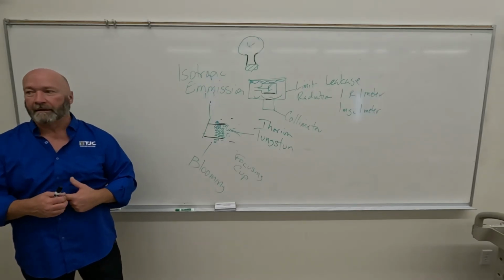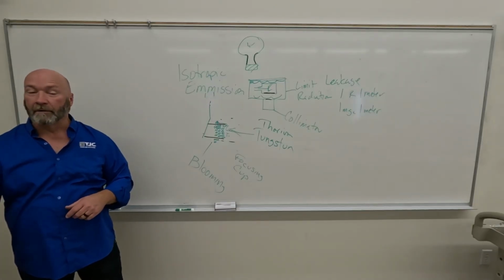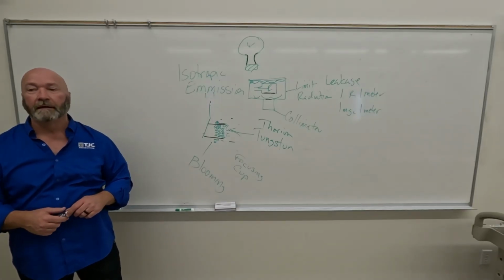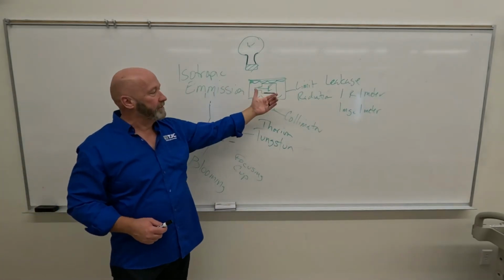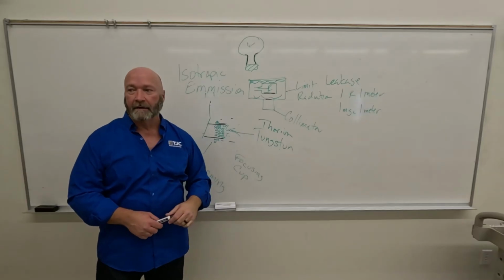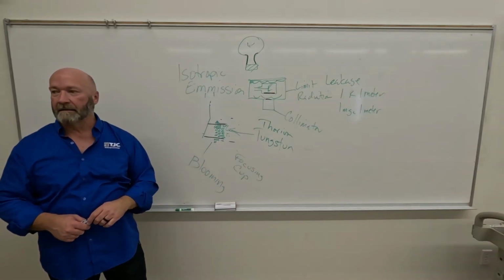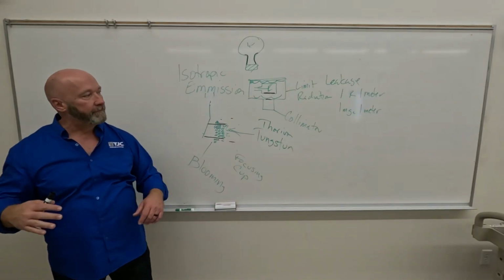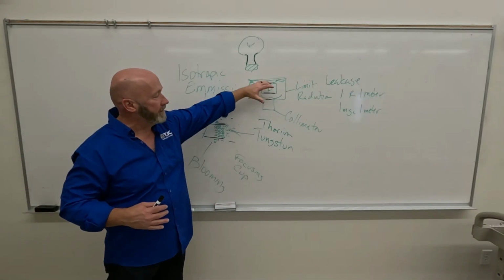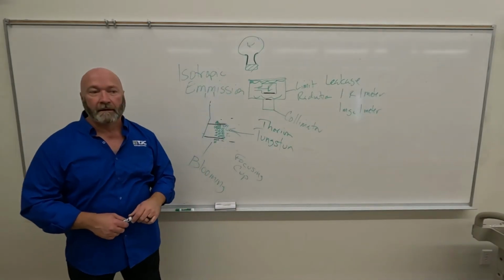Metal, very radiopaque. Okay, so this is a very thin layer. I kind of drew it thick, but it's a very thin layer. Will the x-rays still go through it? Yes. But what it's going to do is absorb some of those low energy x-ray photons before they get out of the protective housing, before they even get out of the x-ray tube.